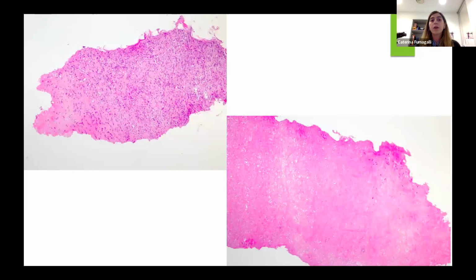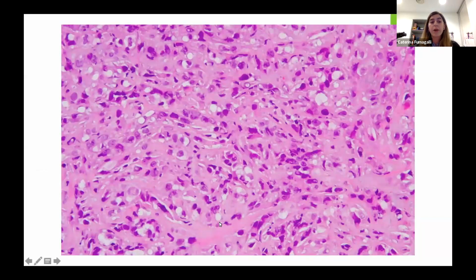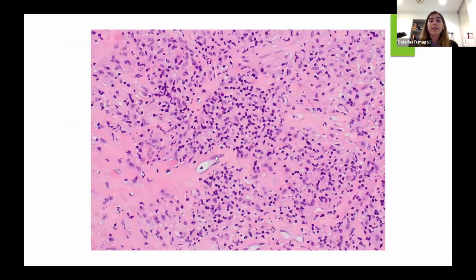The tumor, we can see that it is an epithelioid neoplasm that showed ovoid nuclei with nucleolus and with some nuclear inclusion. The cytoplasm was eosinophilic with quite remarkable vacuolation of the cytoplasm, and there was a fibrostroma. In some areas, a more hyalinized stroma with these monotonous cells. And here we can see that there was a lymphoid infiltrate within.